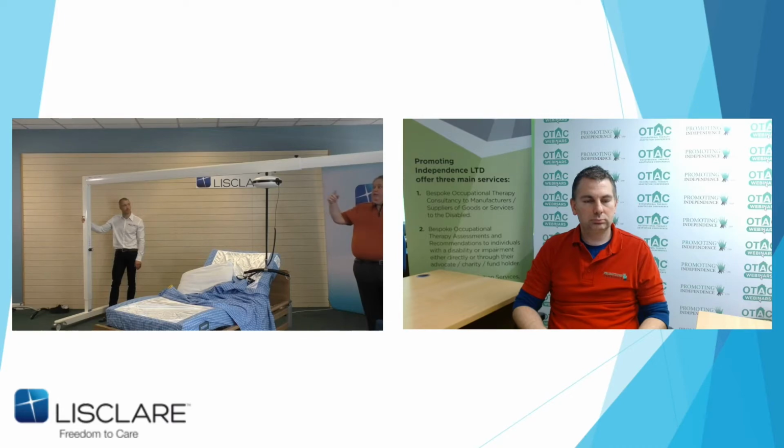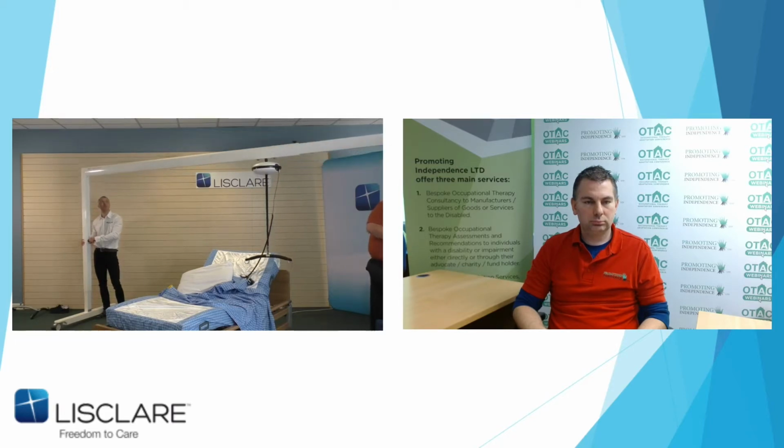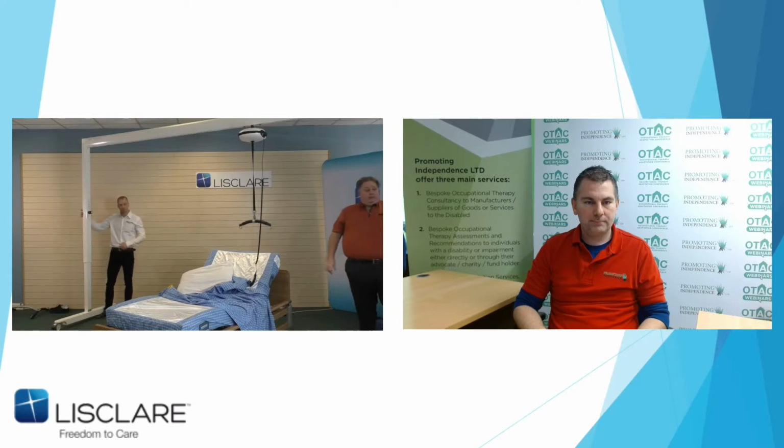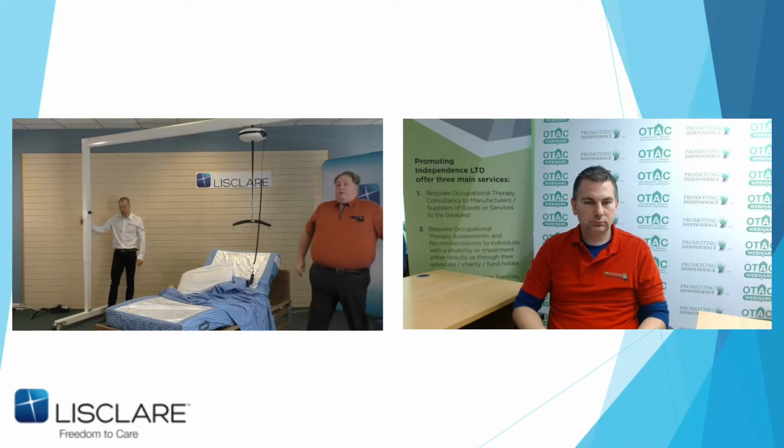Now, I thought the 3 to 4 metre would be more popular. It turns out it's actually the 2 to 3, because most houses I've been working with are garages that have been adapted into a bedroom usually. And that means, hang on a second, here we go, up we go. You can hear the click, so it's all the way down. Okay, over to you, Stuart.